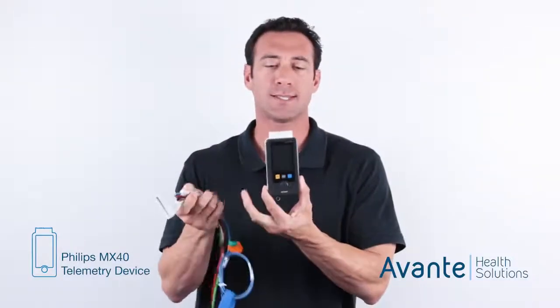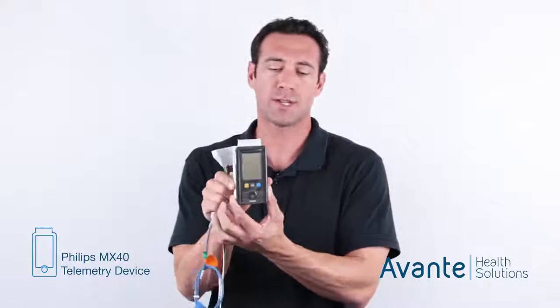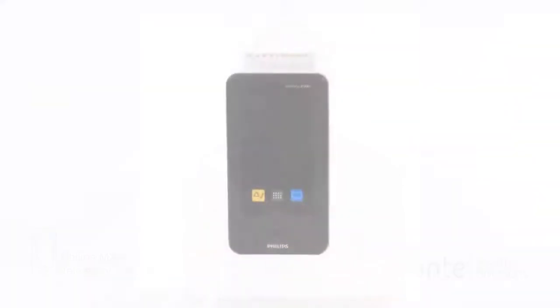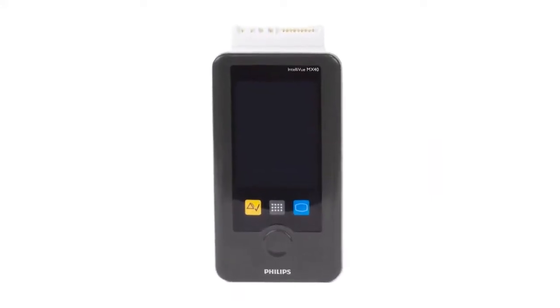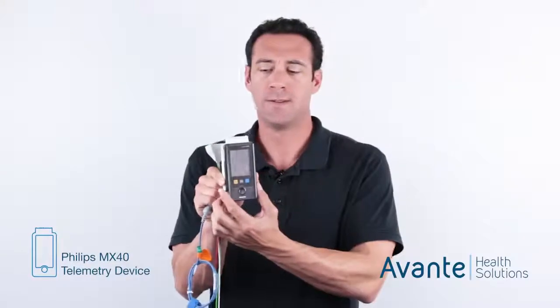So here we have Philips' most current telemetry unit or device. This is going to be known as their MX series. This is the MX40. With this unit, you'll notice, as opposed to the other Philips products, and really any product out there by any other manufacturer as well, it has a screen built into it. This is an LCD screen. It was added so that the clinical staff who's putting these ECG leads onto the patient can look for good placement of the leads and electrodes.